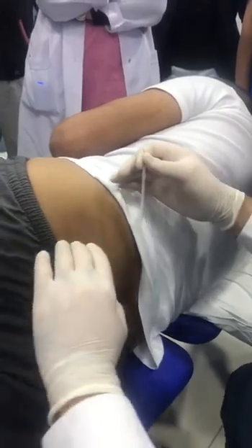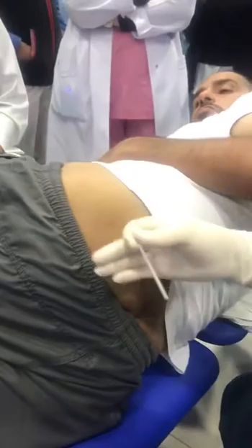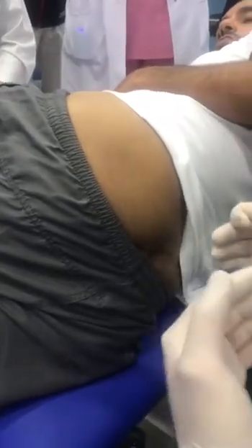Maybe if the electrical feeling was referred down, it may be more towards sciatic, right? The problem sometimes is that sometimes it's giving pain here, but it can also be referring a bit of pain. When the patient has referred pain, he's going to think this is a nerve, because this is the thinking of the patient. They always refer it like a nerve. So depending on the distribution, for example, if they say it reaches the toes, that is not so common, but if it just refers a bit. The main point is whether you are clearly feeling a twitch or not. If you don't feel clearly a twitch, you say, I have to change.